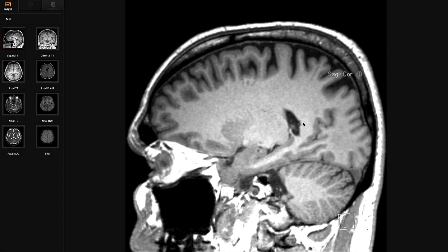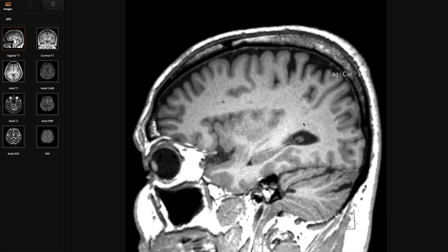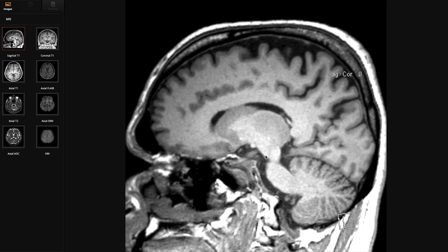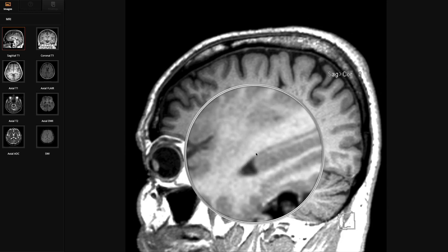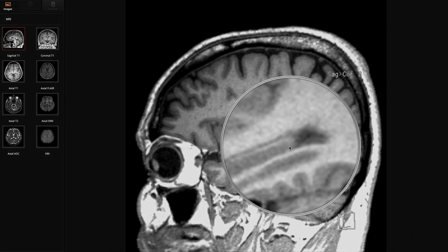We're not used to thinking of the hippocampus as being well-seen on sagittal views, but actually, if you get used to looking for it, you can see it lying here in the choroidal fissure. And often you get this lovely sort of hot dog, sausage in a bun appearance.